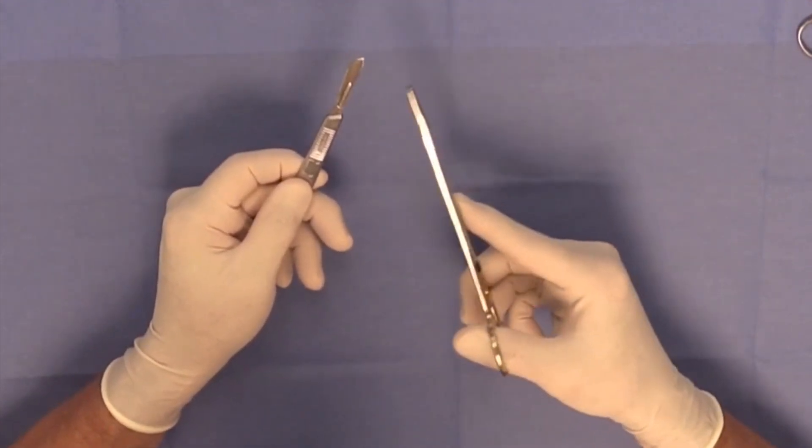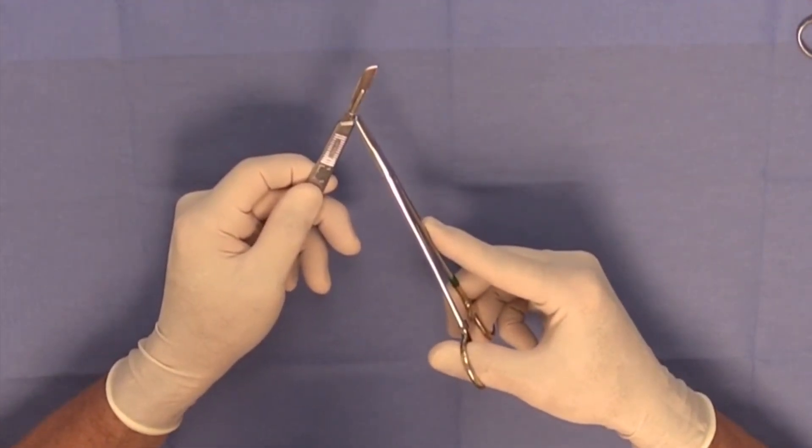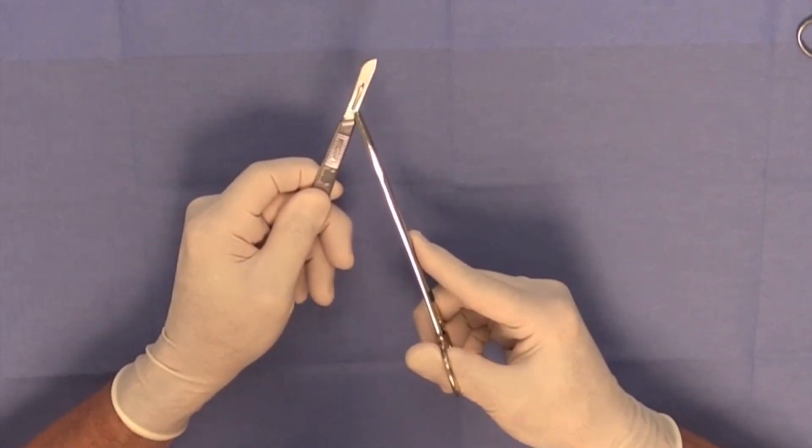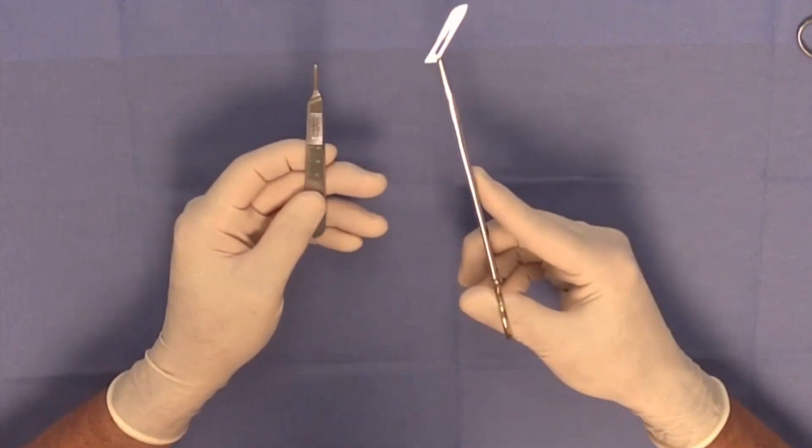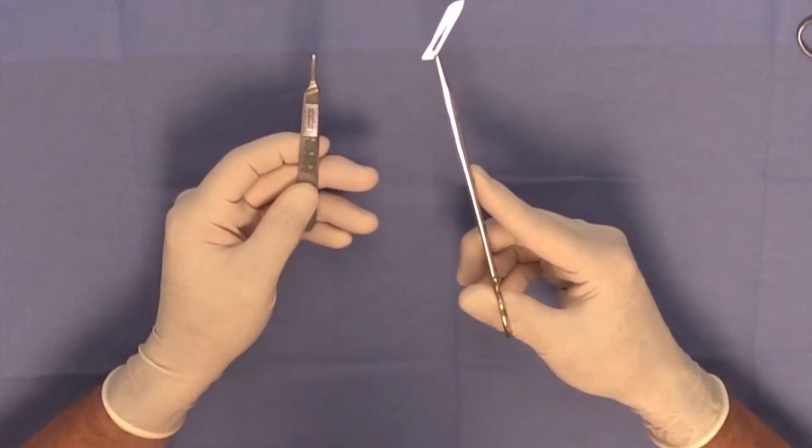To remove the scalpel blade, again, you could do this with your fingers, but it's cumbersome and dangerous. You just simply lift up on the back of the blade and slide it off carefully using an instrument that's not the tips of your fingers.